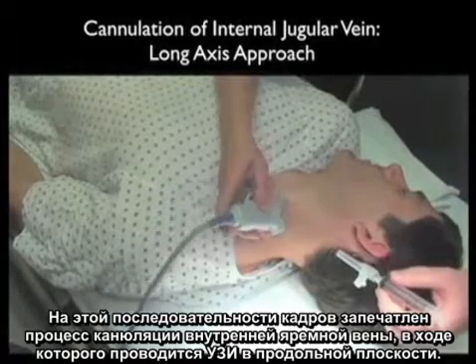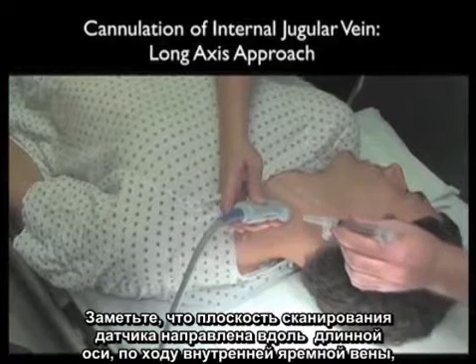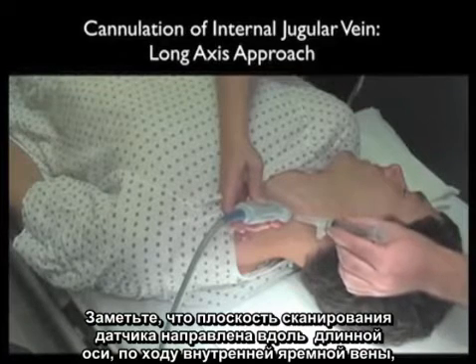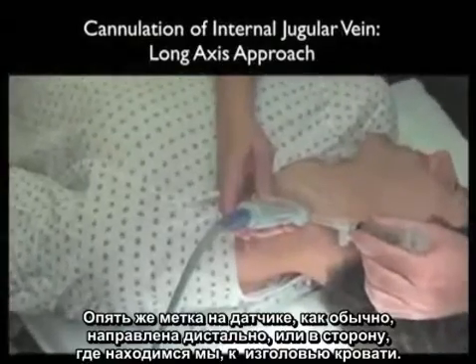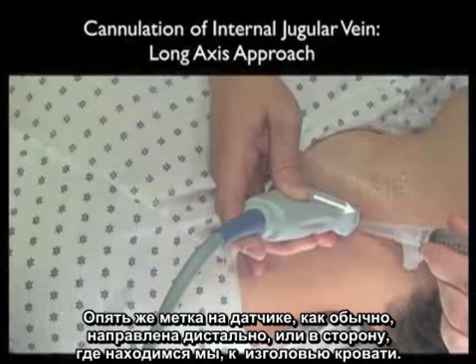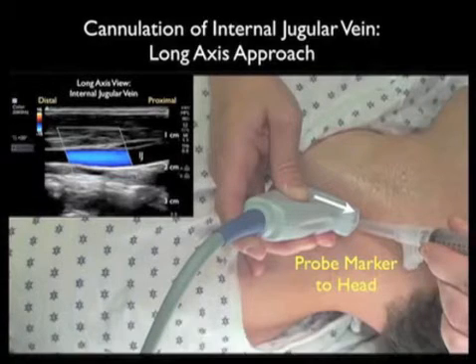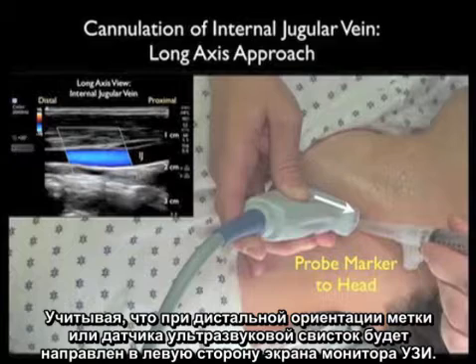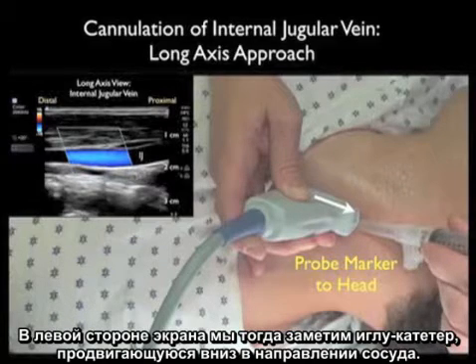This video sequence shows cannulation of the internal jugular vein using the long axis trajectory. Notice we swivel the probe into the long axis orientation along the course of the internal jugular vein as it runs up and down the patient's neck. By convention, the probe marker should be oriented distally, towards us as we stand at the head of the bed. The cannulating needle will come in at a 45 degree angle under the distal aspect of the probe. Since the distal aspect or marker orients towards the left of the ultrasound screen, we can look towards the left of the screen for the cannulating needle coming down to the vessel.